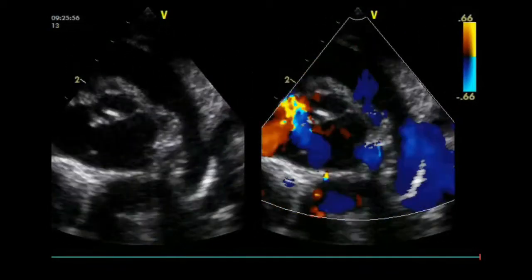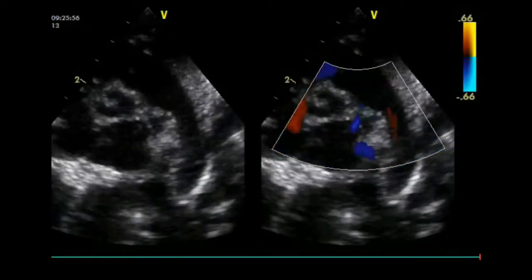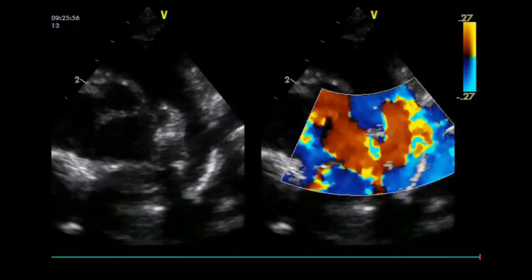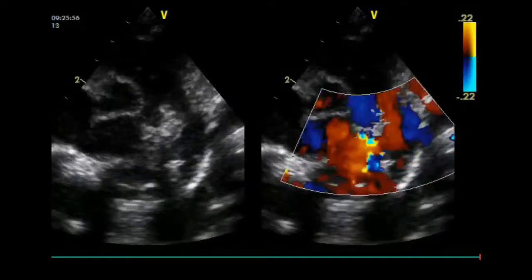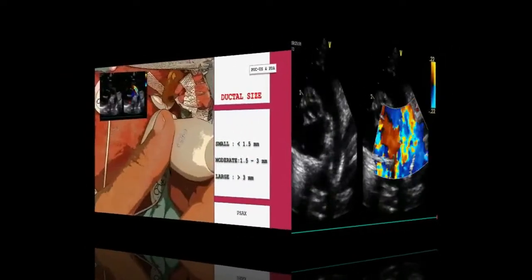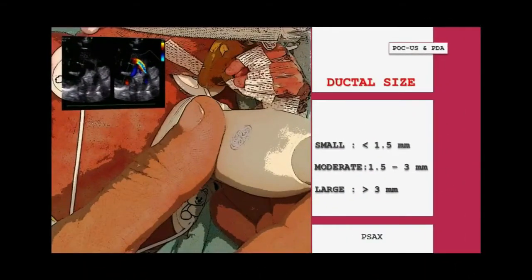Measurement of the ductal size is not very accurate. It is not recommended to use color Doppler, which can exaggerate the size. A PDA is considered small at less than 1.5 mm, moderate when it ranges between 1.5 and 3 mm, and large if the dimension exceeds 3 mm.